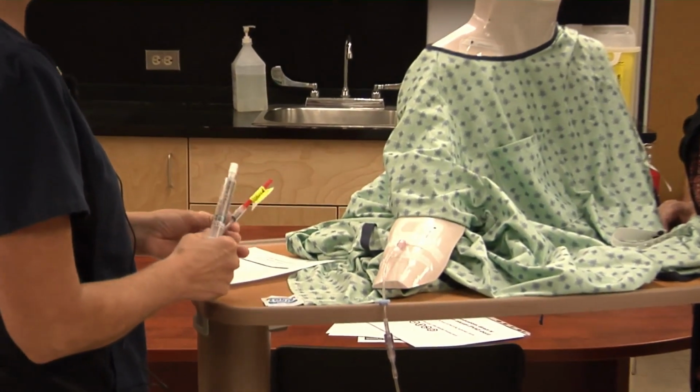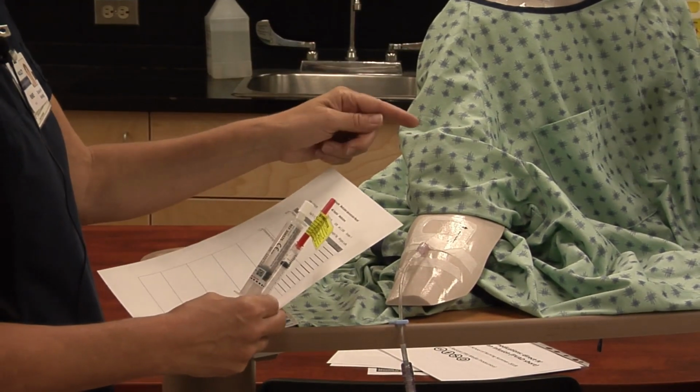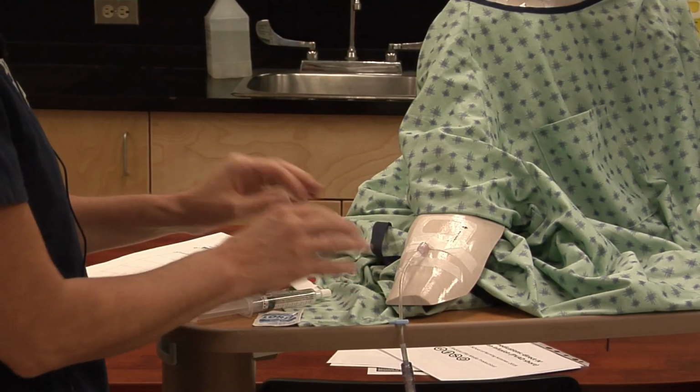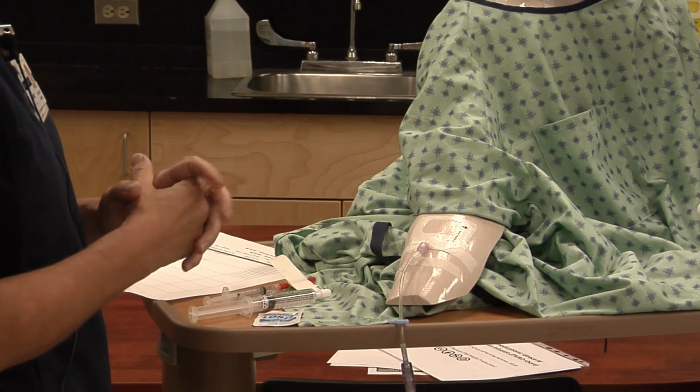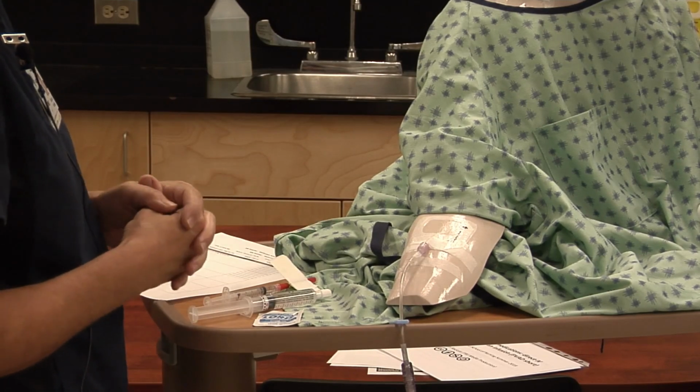I have my flush ready. I brought my MAR to the bedside. I've done my 2 patient identifiers, and all is well. I've informed the patient what I'm going to give them, and if there's anything I need them to be on the lookout for, I've informed them about that.